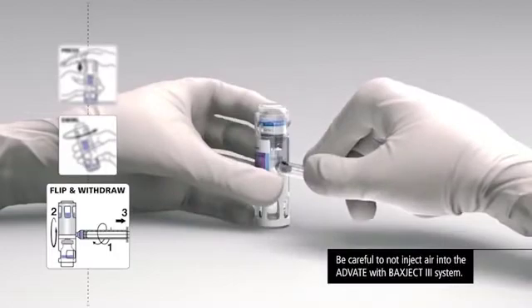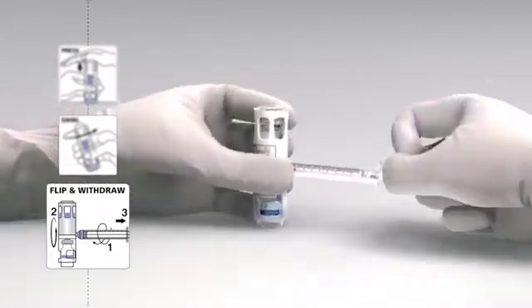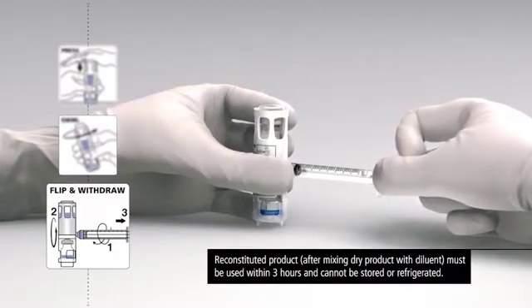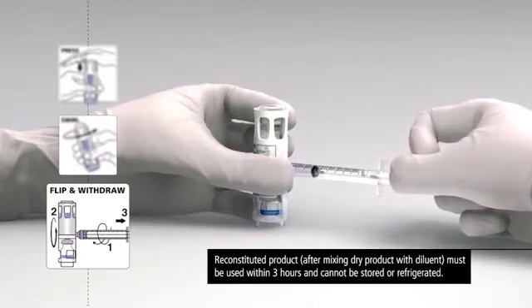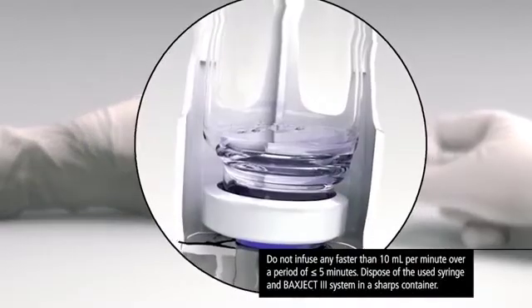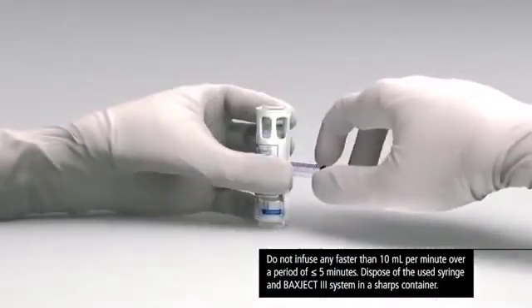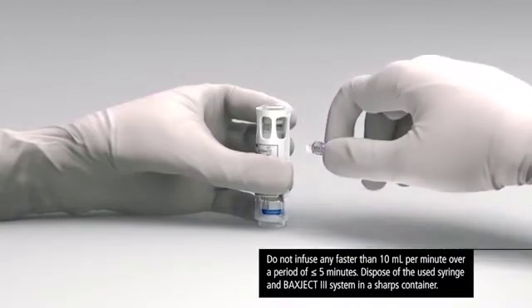Screw the syringe into the system and turn the system over so that the diluent vial with the blue stripe is on the bottom and the vial containing ADVATE solution is on top. Slowly draw the solution into the syringe. Be careful not to inject air into the system. It is acceptable for a small amount of liquid to remain in the vial. Once you've collected the reconstituted ADVATE, you are ready to continue with the infusion process.